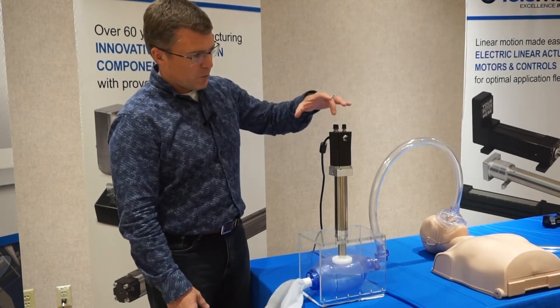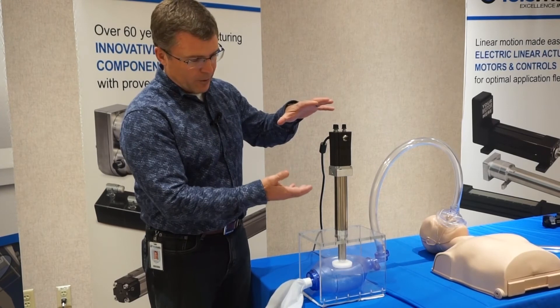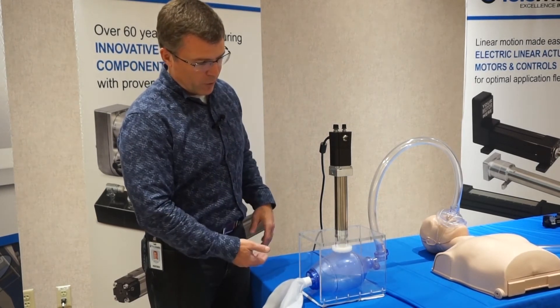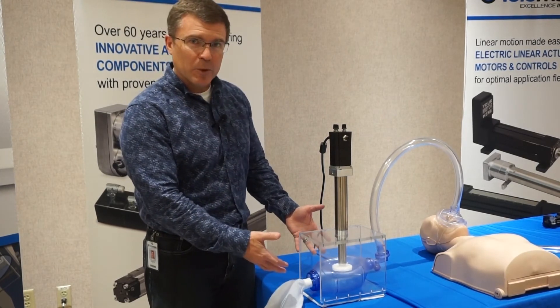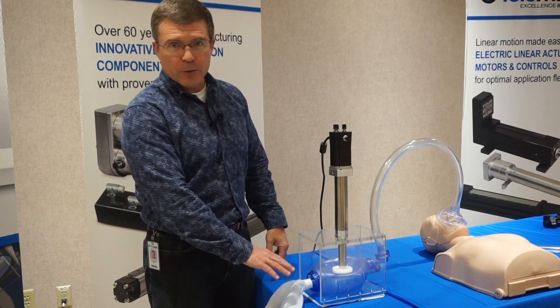Three simple controls — length of stroke, speed of stroke, and the dwell or the pause of that stroke — allow me to have complete flexibility over what's happening with this device and its influence.